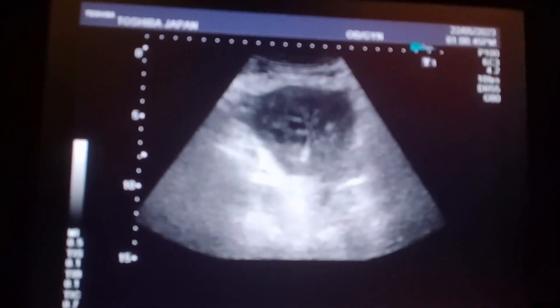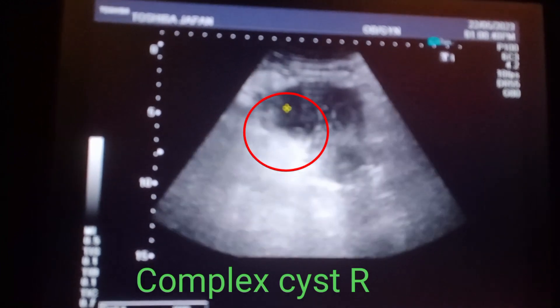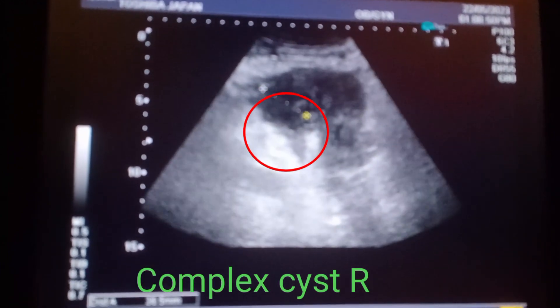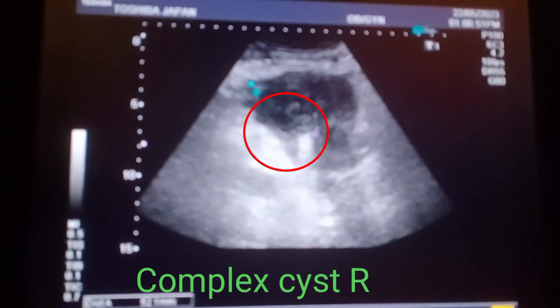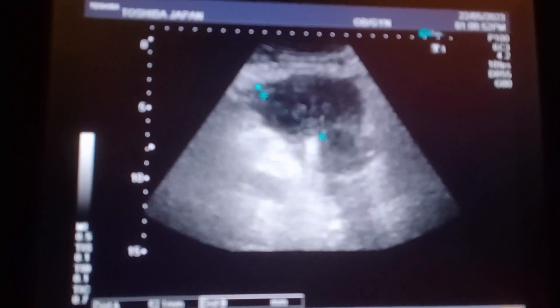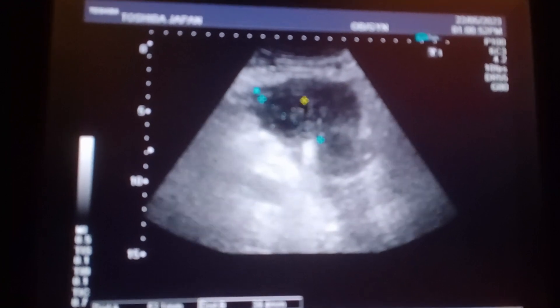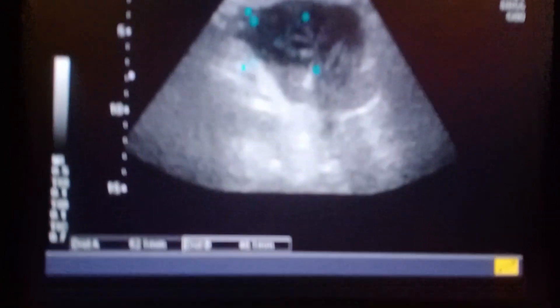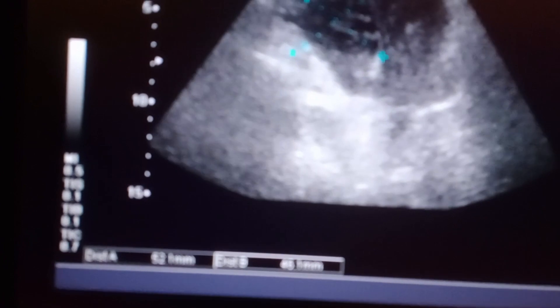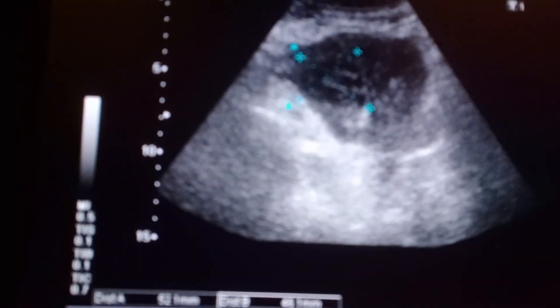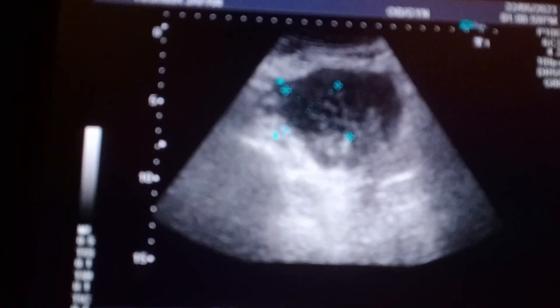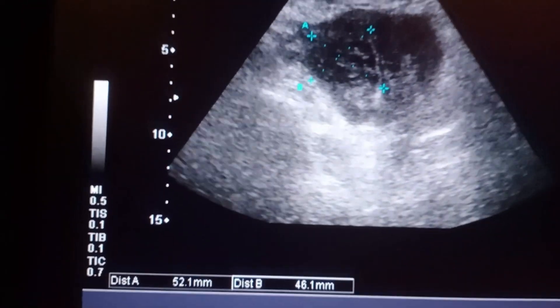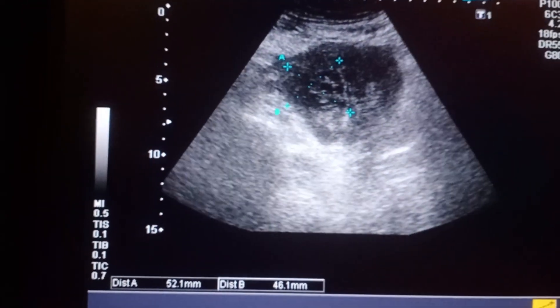This is the complex ovarian cyst with internal septation and having thick wall. The uterus is lying in front of the cyst and the measurement is about 5 x 4.6 cm.